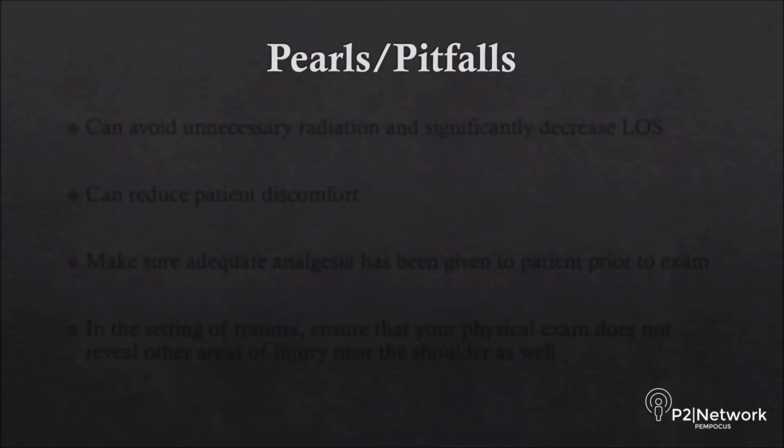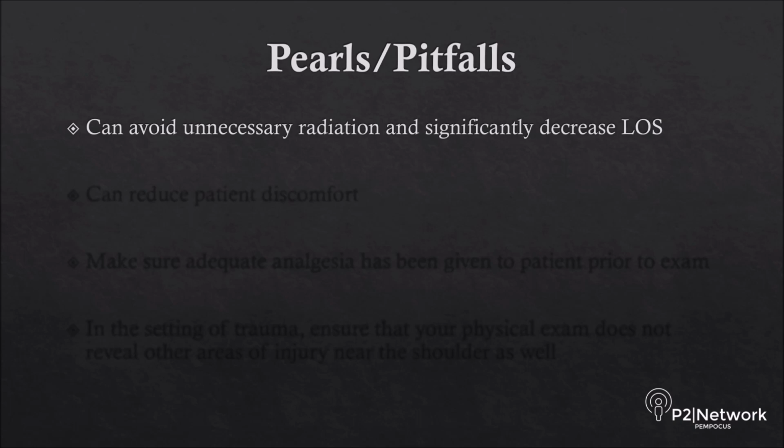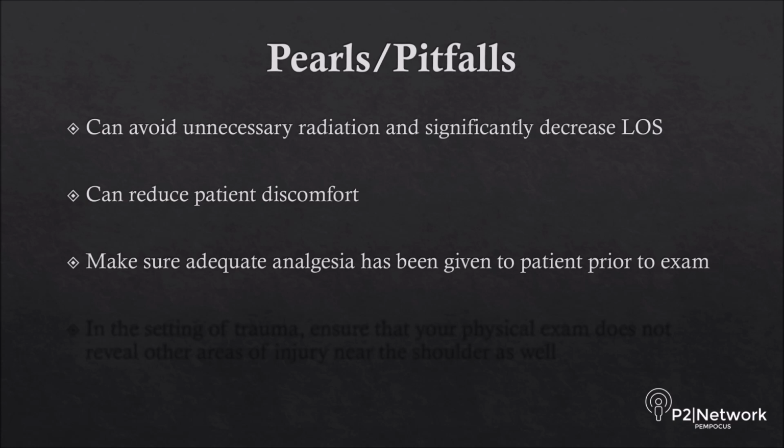Some pearls when it comes to shoulder POCUS. If used appropriately and in the right clinical setting, we can avoid unnecessary radiation and significantly decrease length of stay. It can also reduce patient discomfort. One pitfall can be obtaining adequate images, especially if the patient is experiencing a significant amount of pain. So make sure adequate analgesia has been given to the patient prior to the exam.